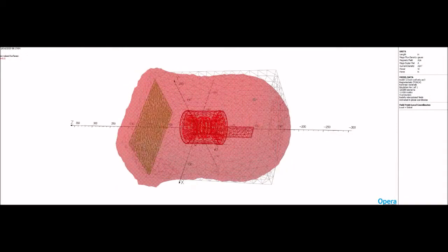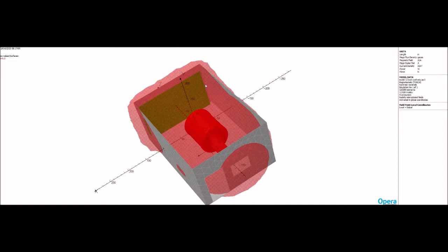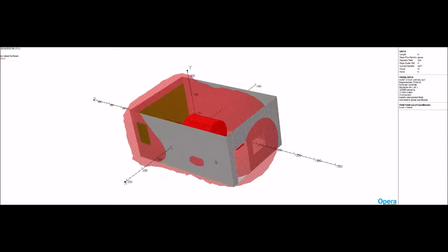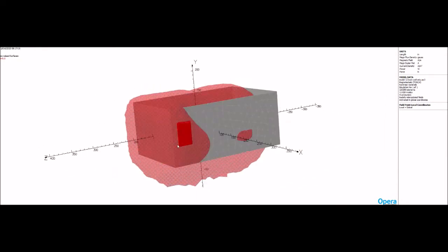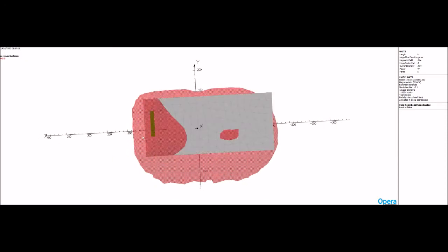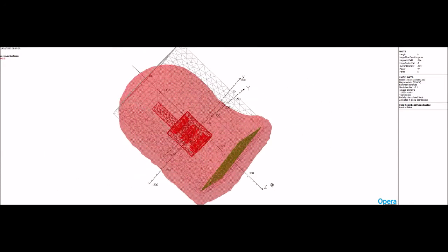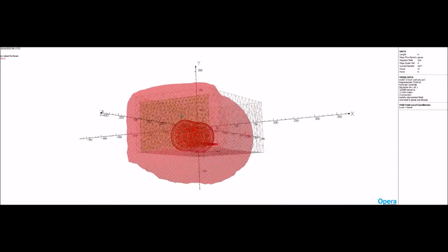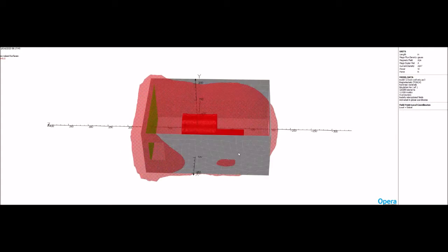This is the same magnet with the addition of steel on the back wall, about half inch of steel on the back wall. And although you can see that it's now being pulled in to some degree, it's no longer just coming out and around. It's been flattened out, but you can also see that it's not been mitigated. There's 5 Gauss just pouring out and around that steel wall. So that's not going to do it. We're going to have to add some more steel, and I'll show you how that works.